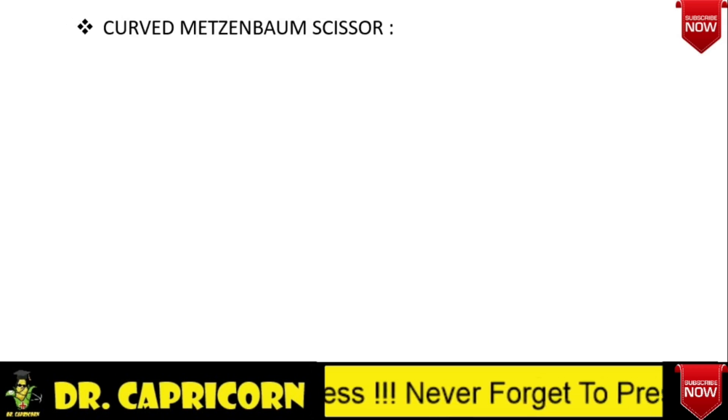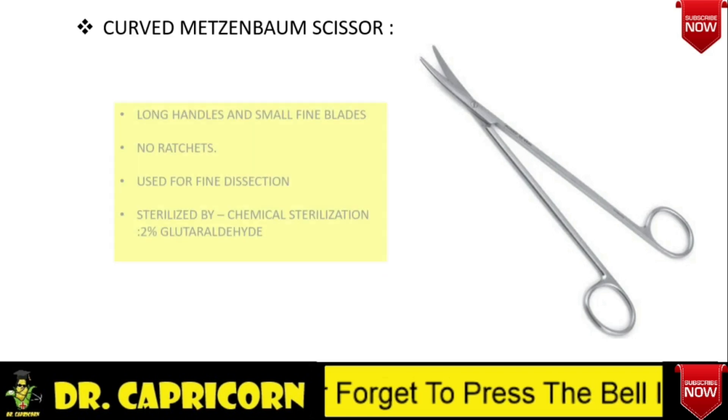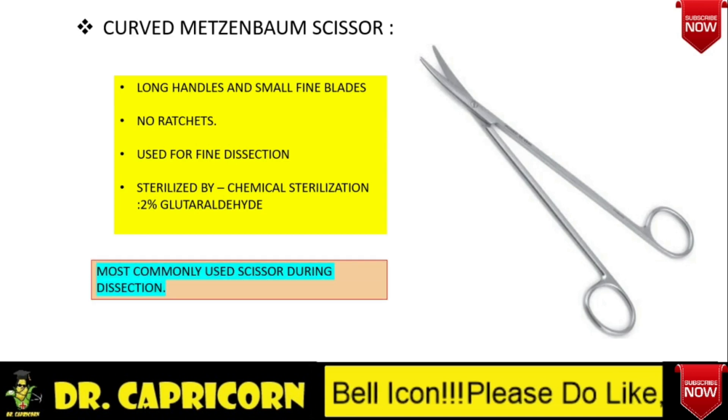The next type of scissor is the curved Metzenbaum scissor. It has two rings, a long handle without ratchet, a screw joint, and small short fine blades. It is mainly used for fine dissection and is the most commonly used scissor for dissection purposes. This is also sterilized by chemical sterilization.